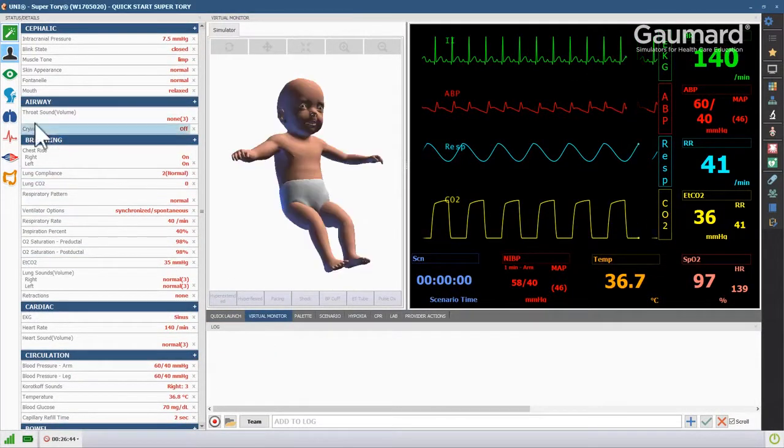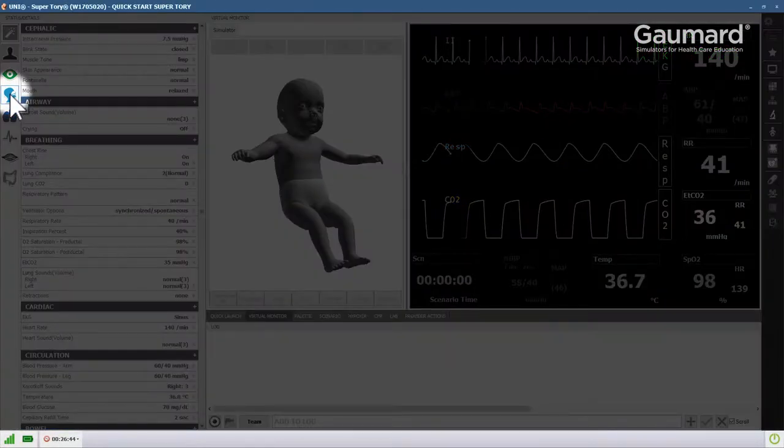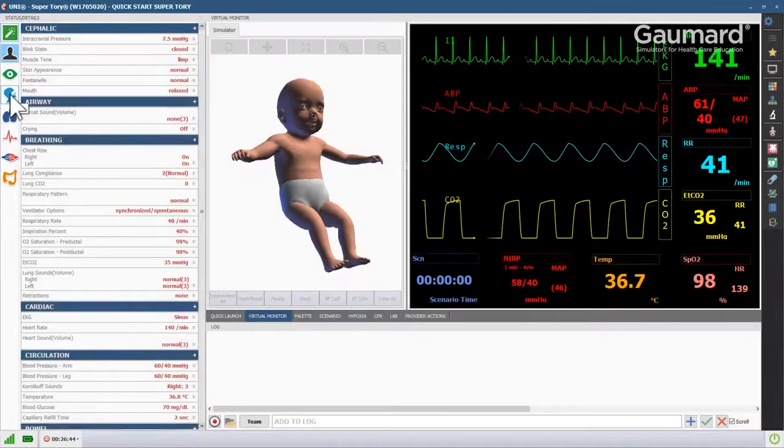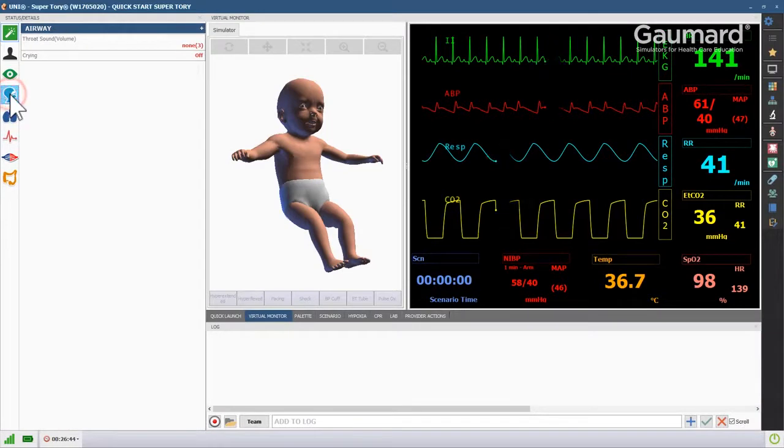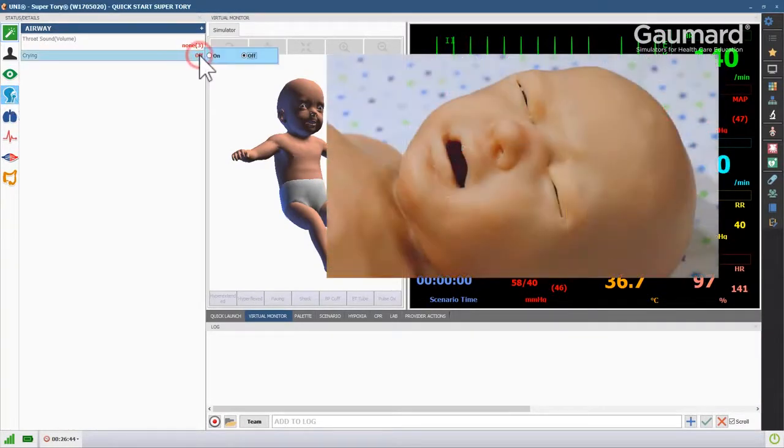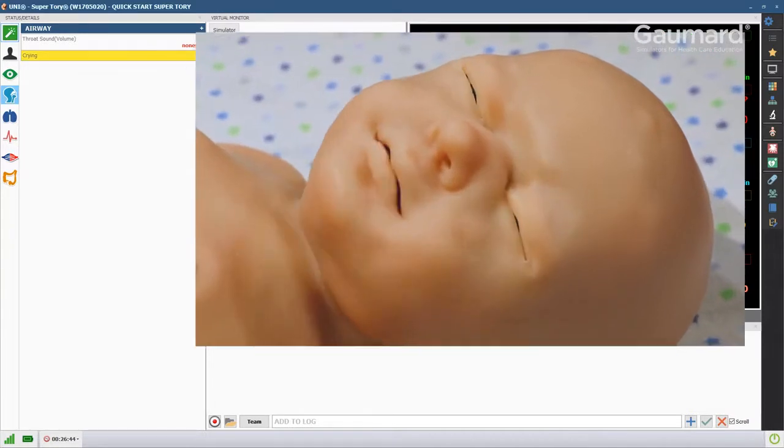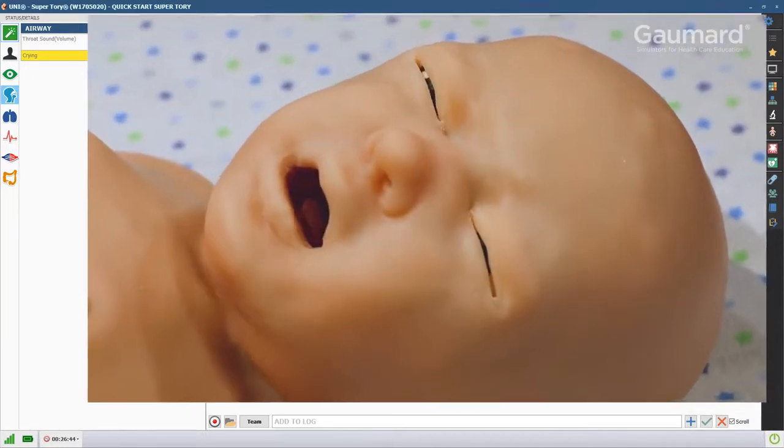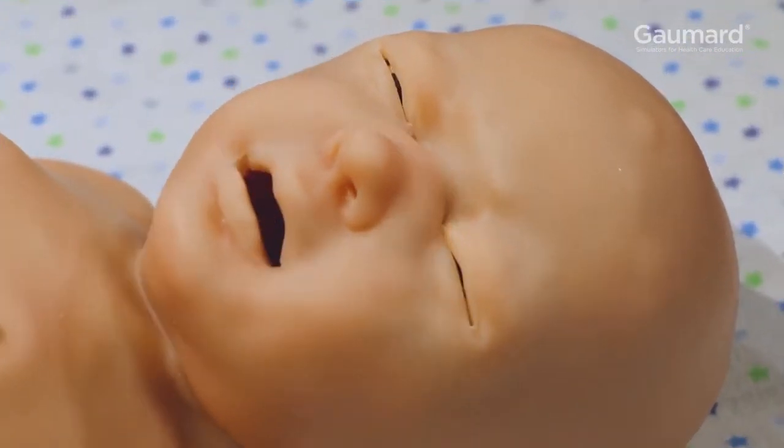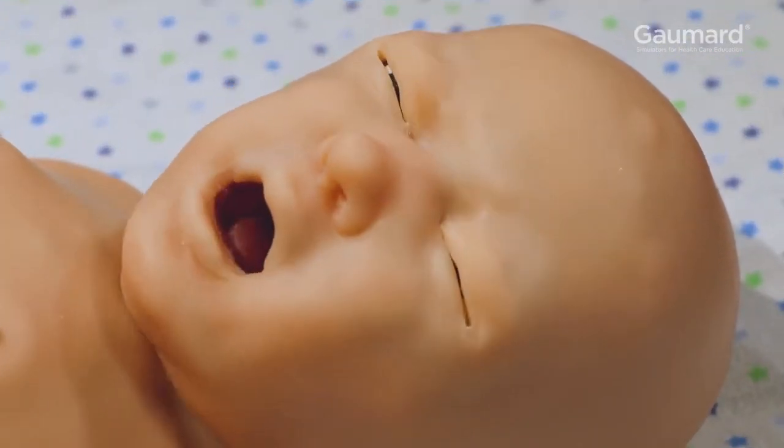To activate crying, open the airway submenu and click the crying vital, then click the button next to On. While Supratory is crying, the mouth and eyes will move realistically.